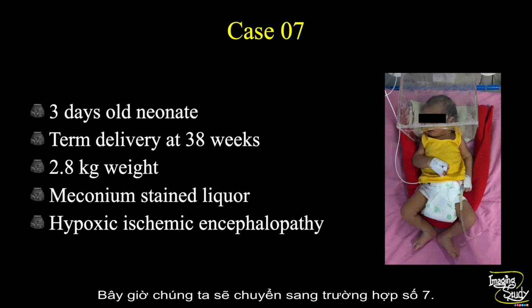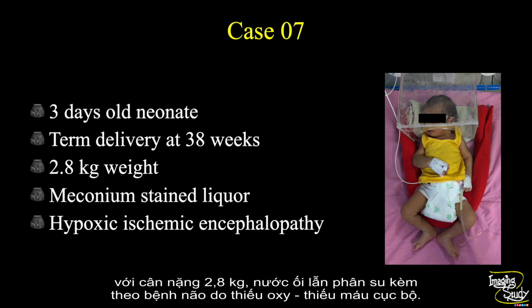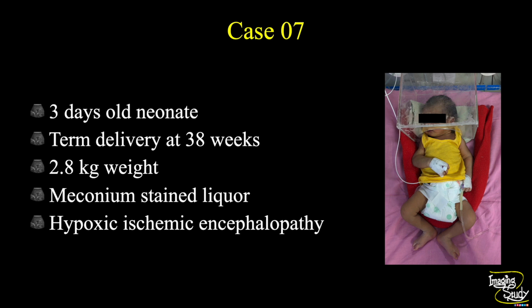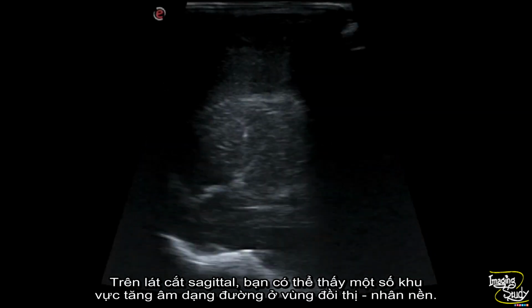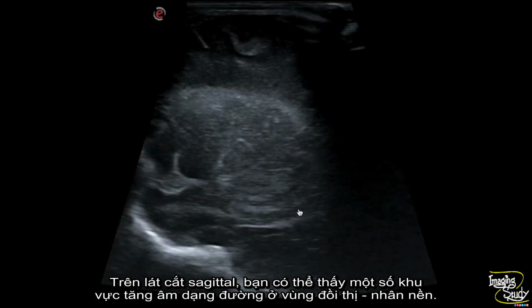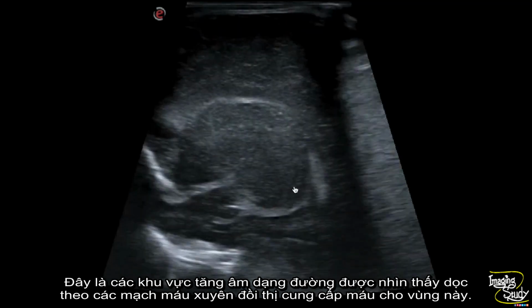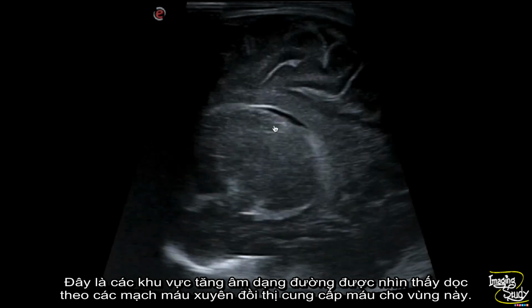Now let's jump into case number 7. This is a 3 days old neonate with term delivery at 38 weeks. The birth weight was around 2.8 kg. There was meconium stained liquor with hypoxic ischemic encephalopathy. Here on parasagittal section, you can see there are some echogenic linear areas at the thalamoganglionic region. These linear echogenic areas are seen along the thalamostriate vessels which supply this region.